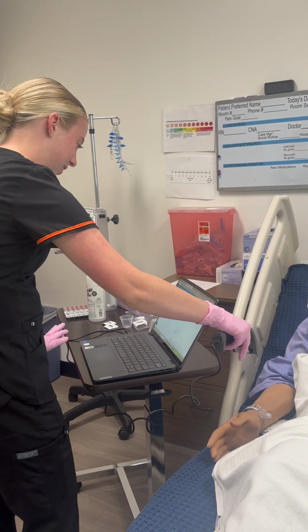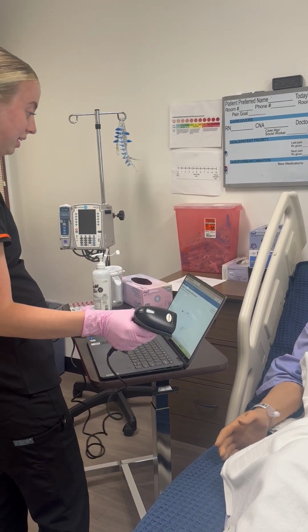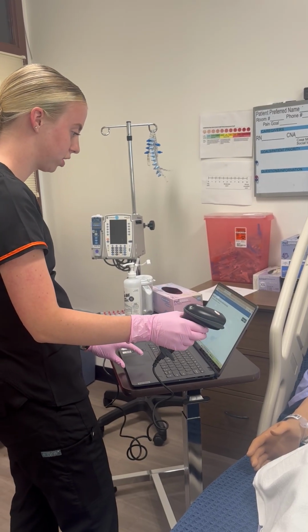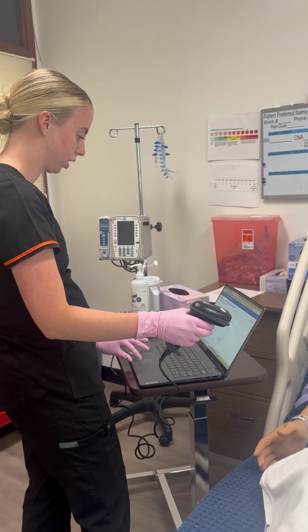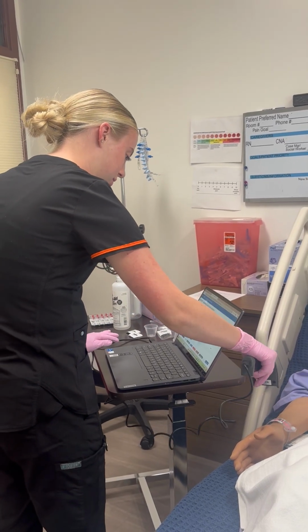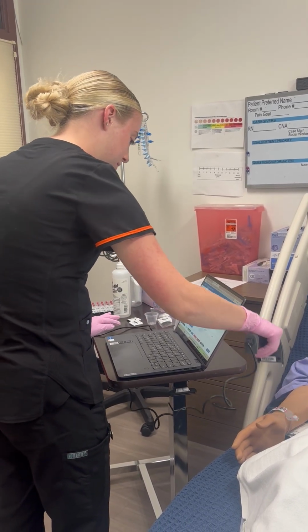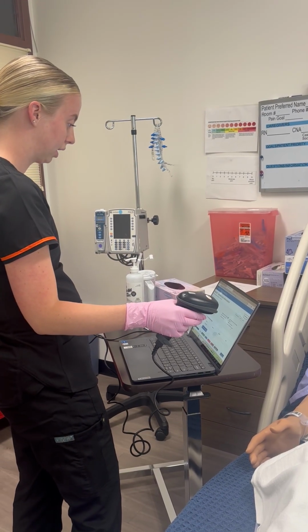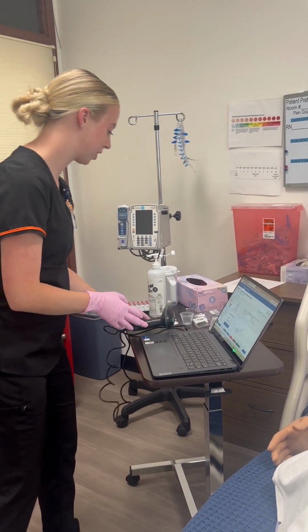Nope. Does not want to scan my patient. I'm going to try and refresh one more time, see if I can get it to work, and if not, we'll move on. Okay, it's not going to work right now, but that's okay.